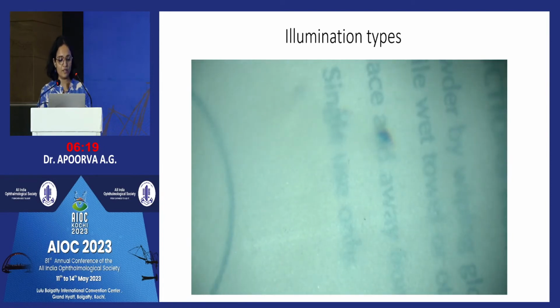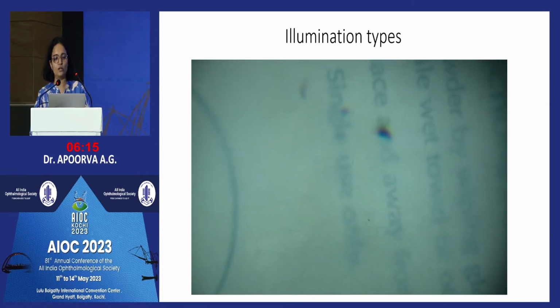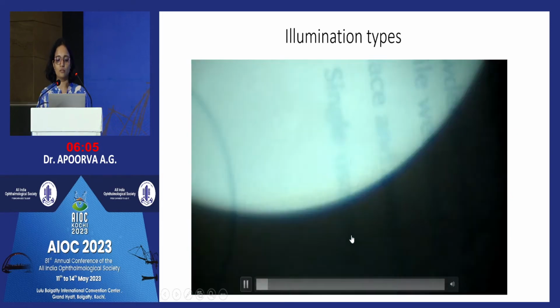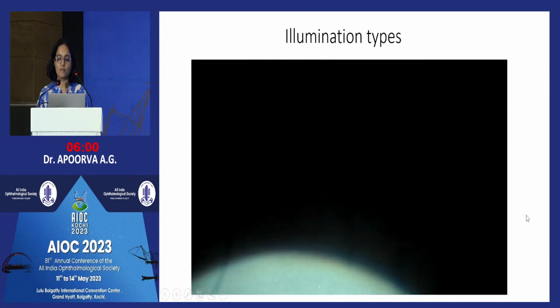The coaxial illumination can be exclusively coaxial, wherein only the retro illumination is on, or it can be coaxial illumination with the surrounding light, or it can be just the surrounding light on. Those are the modes of different degrees of coaxiality that we can use depending on our need.